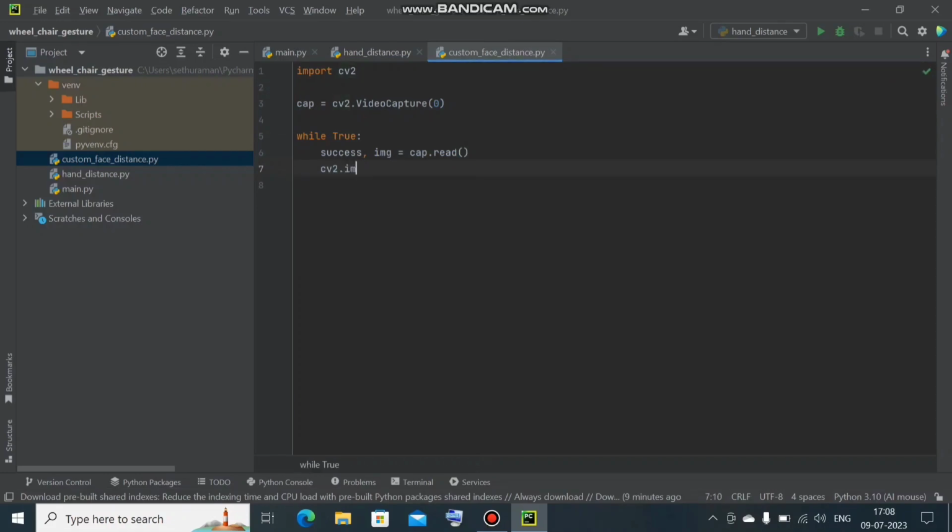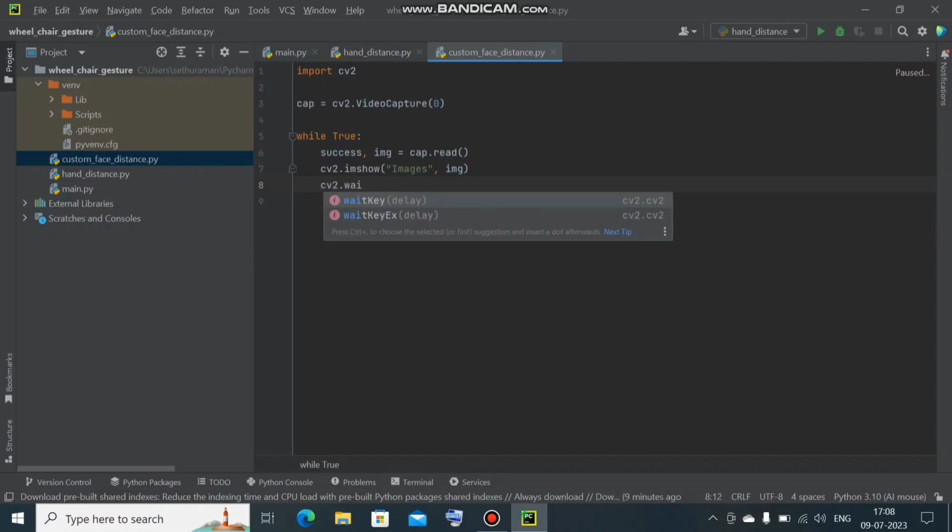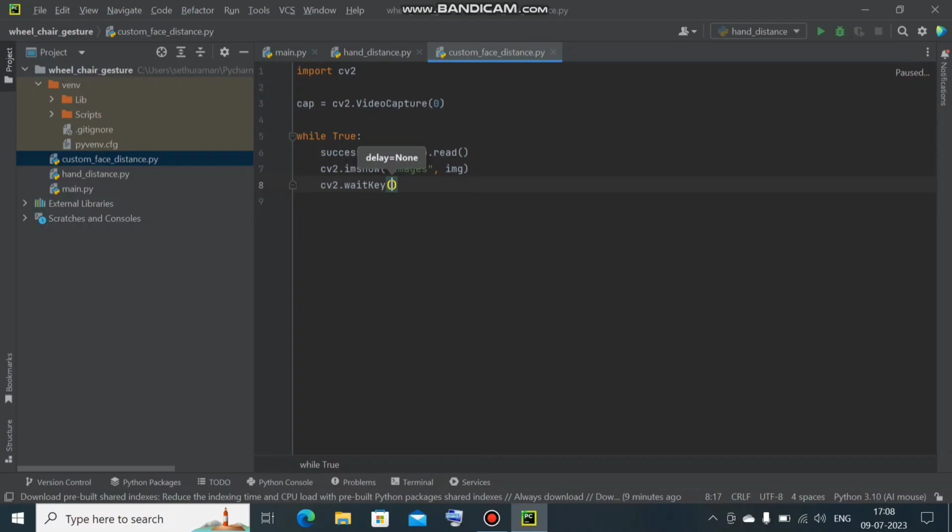Then I'm going to show, in the window name. The window name is nothing but the name in which it needs to display, and I need to show the image where I have saved this cap. Now we need to call the waitKey function, to get a delay of 1 here. If it is an image, we will put 0 here, but we are going to operate on video, so it is 1. Now let us check.